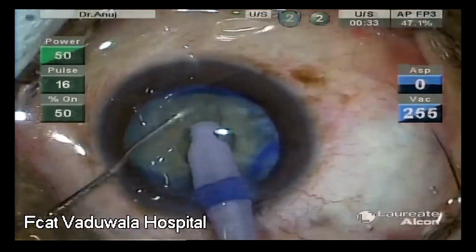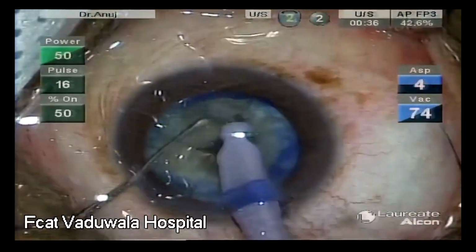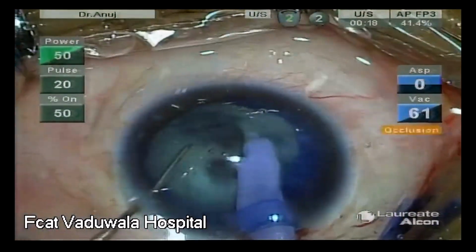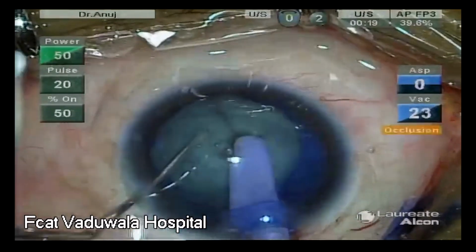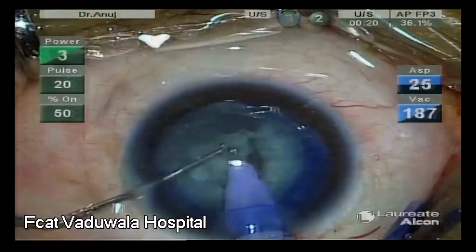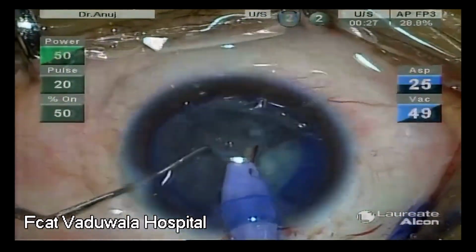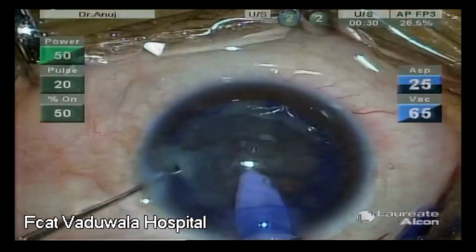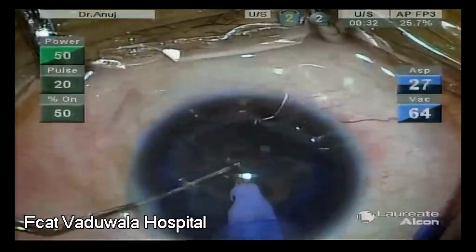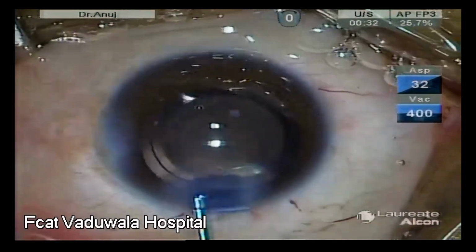When it comes to mature cataracts, performing the chops using the central well is a piece of cake, and ironically, it looks like cutting pieces of a cake due to the arrangement of the cataractous lens fibers, which completely separate with almost negligible force. Finally, developing these solid rules and inculcating these textbook habits in our surgery will exponentially reduce the risk of complications and deliver consistent results to our patients.